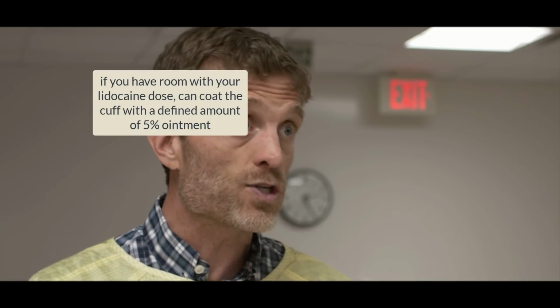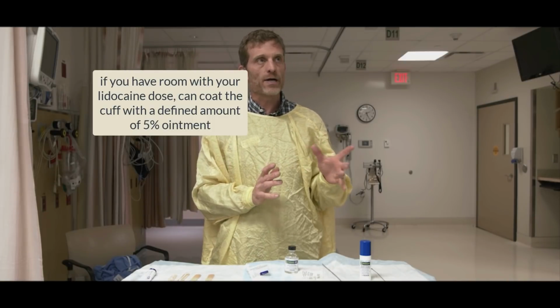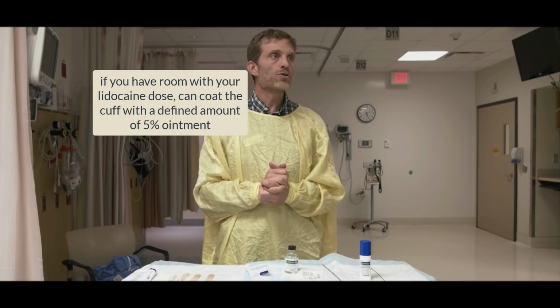So as part of your preparation, you're going to want to know what to do after you get the tube. Now you're going to have some subglottic anesthesia, but when you're doing this, and that reminds me, indications to do this. When you're doing this for a patient that has obstructing airway pathology, once you've captured the airway, most of these patients don't have hemodynamic problems. You're not going to have issues with sedation. So you can have your sedation plus or minus your paralytics ready to go for post-intubation.